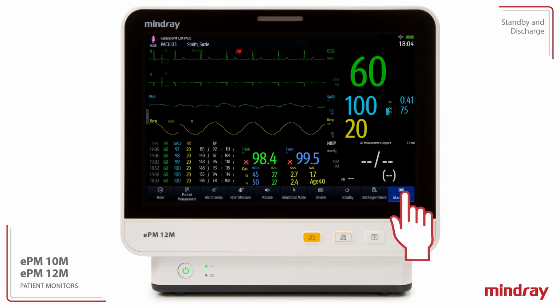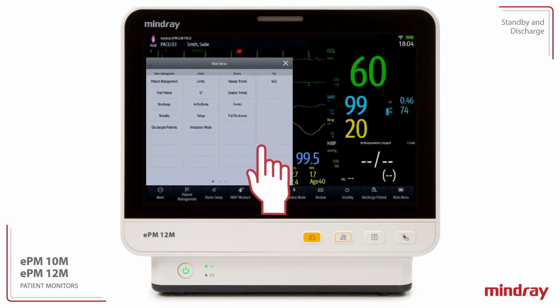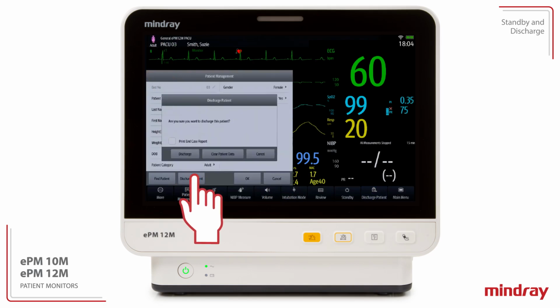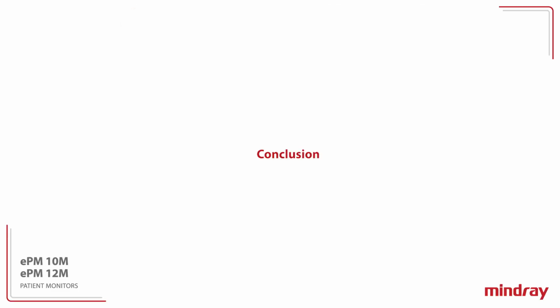Select Discharge from the Patient Management column from the main menu, or select the patient icon in the upper left corner of the display and select the Discharge Patient button. A confirmation message is presented before completion of discharge. Select Discharge to clear the data of the current patient and load the default configuration. The discharged message appears on the main screen. The clinician may admit a new patient by selecting the Patient Management button, or start monitoring by selecting the Monitor button on the main screen.